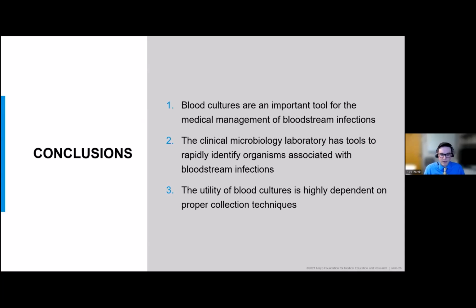But for them to be useful, it requires really good teamwork and collaboration between the laboratory and the collecting staff to make sure that the proper collection techniques are used and the proper specimen is submitted to the laboratory, so that we can, as a team, provide the best information and results possible back to the healthcare provider, so that we can help and impact patient care to the best of our ability.